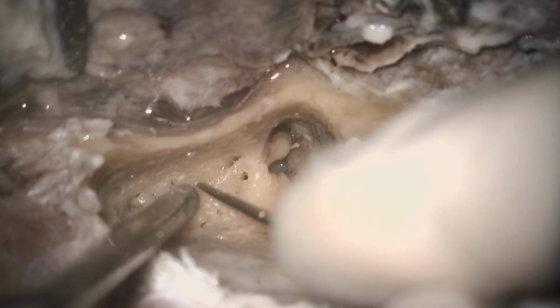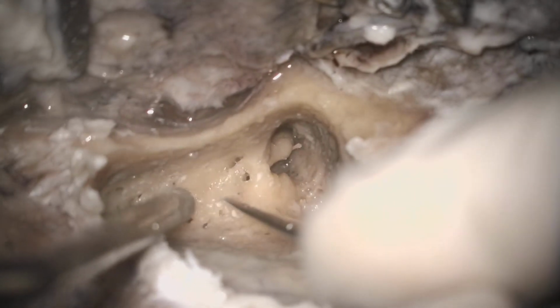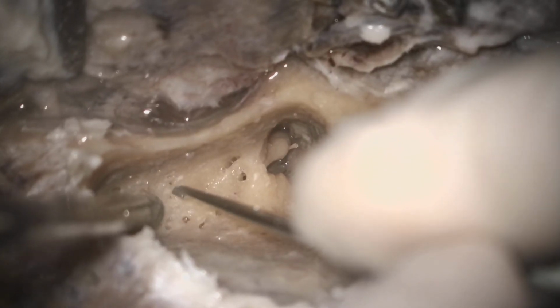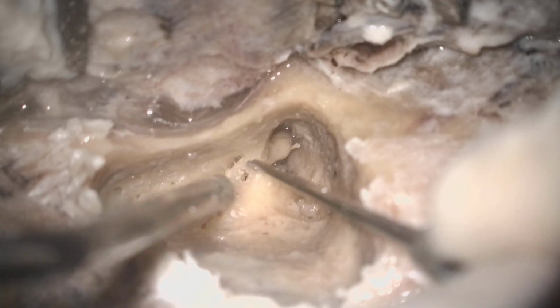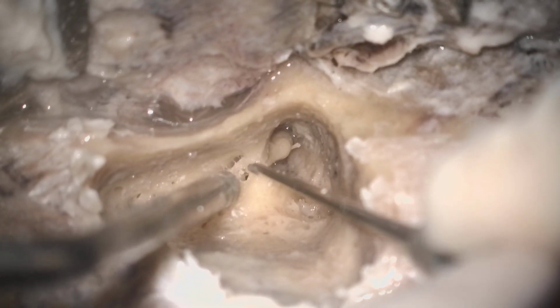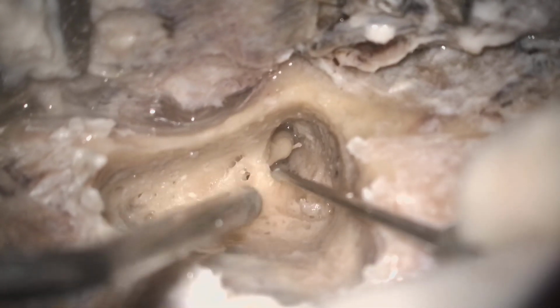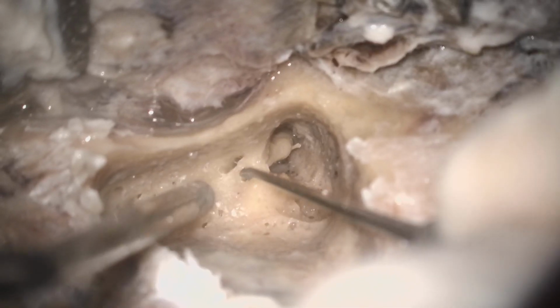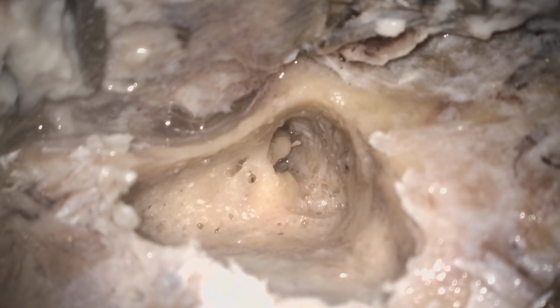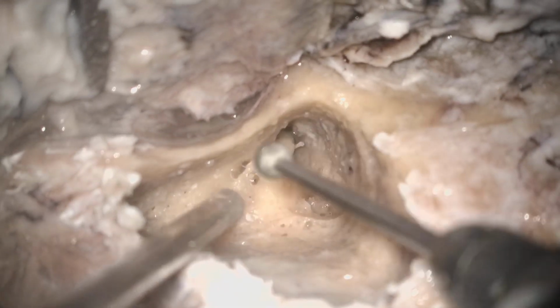Don't go at that level, because here will be the facial nerve, here will be the chorda tympani, so the chordofacial angle will be there. So this is the narrowest part and this is the widest part. So always start your posterior tympanotomy in the superior portion, very near to the lateral semicircular canal, and make the incus buttress very thin so that you can directly enter into the middle ear without damaging these important structures, the facial nerve and the chorda tympani.